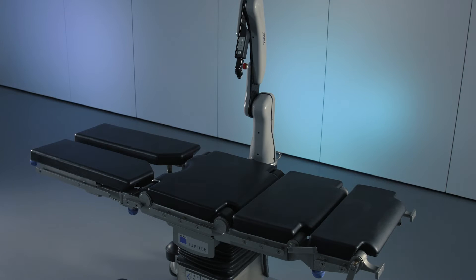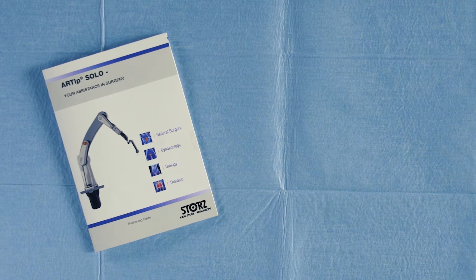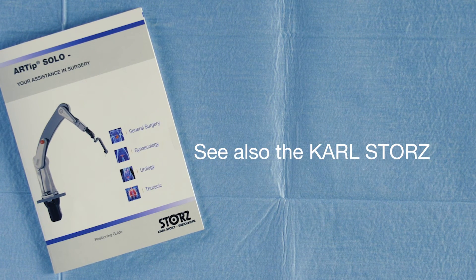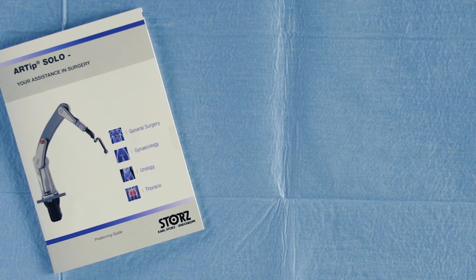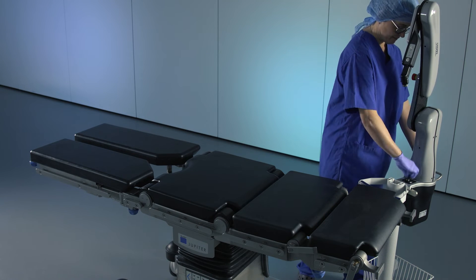Positioning of the Artip Solo depends on the procedure and location of the operating surgeon. For more specific information by procedure, please check out the Karl Stortz positioning guide. It is recommended to set up the Artip Solo before the patient's skin is cleaned and sterile draped.